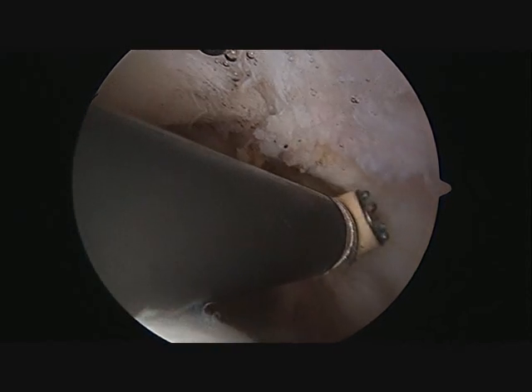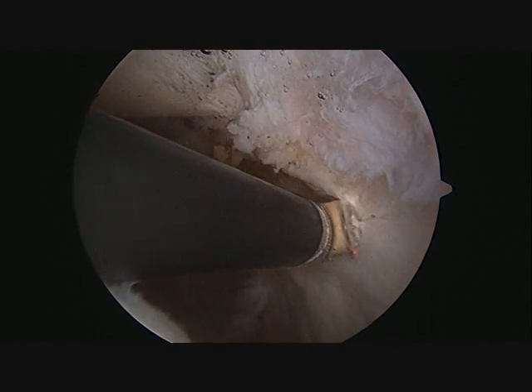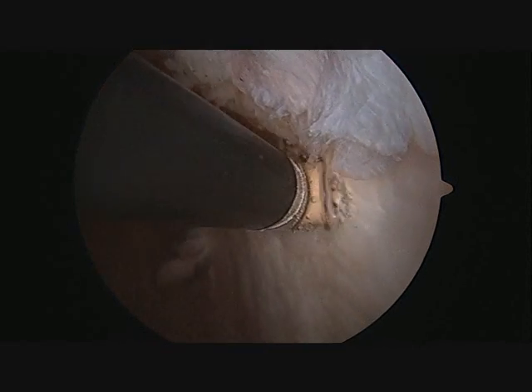In this situation, the retinaculum is too tight and can be released. Once it is released, the kneecap can glide smoothly through the center of the knee.